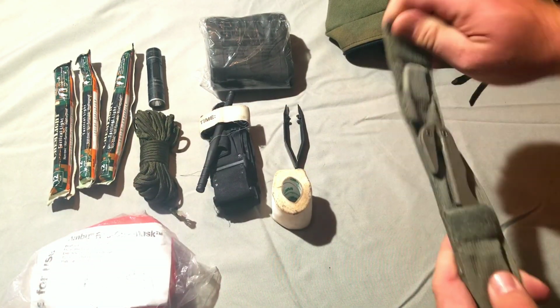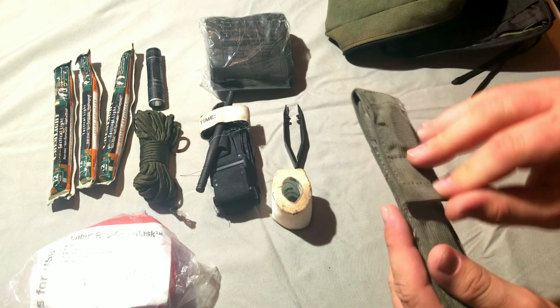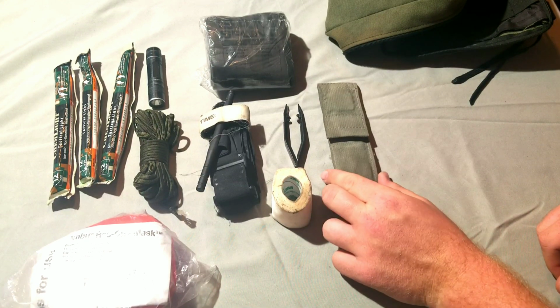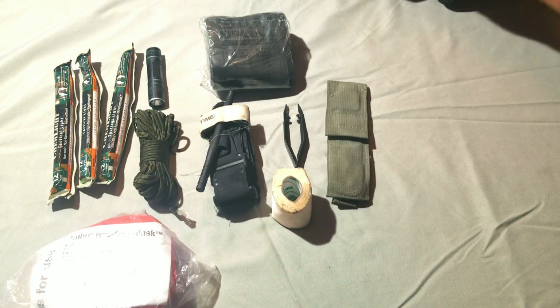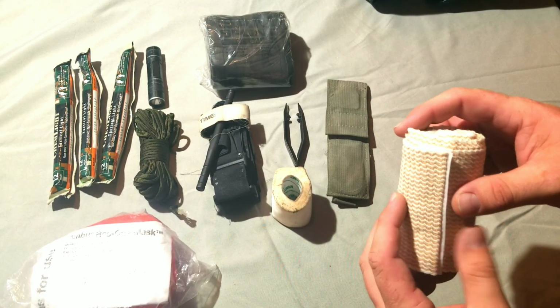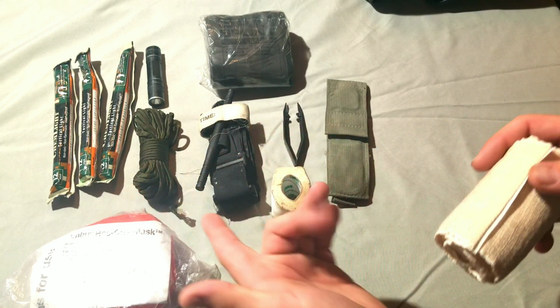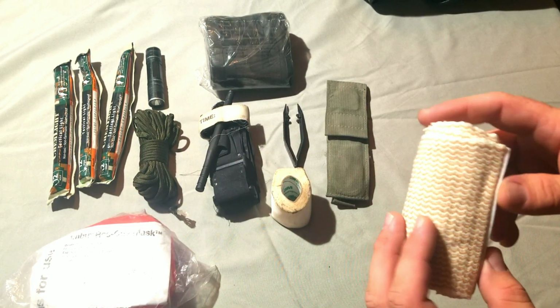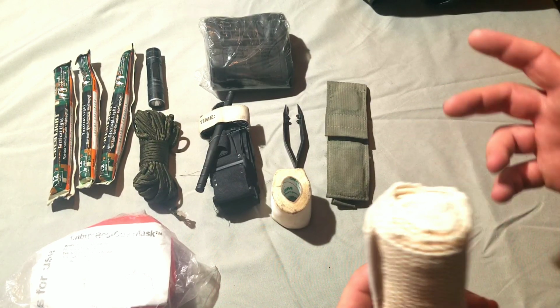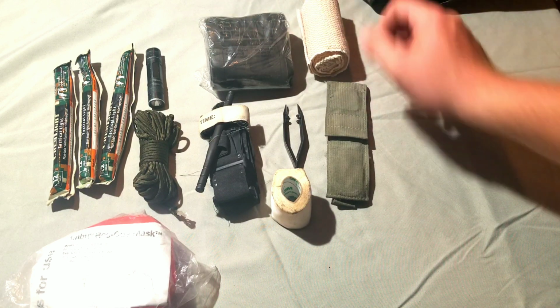You have a seatbelt cutter. Really good to have, especially if someone's trapped in a vehicle or something like that. You roll up on an accident. An ace bandage. Another really good thing to always have. It's very multi-use. It can be used as a tourniquet along with a 550 cord, but you gotta be careful because it's really thin. So something like this could be used as a tourniquet, you know, wrap a sprain, bandages, however you need to use it. Once again, a lot of stuff has multi-use whenever it comes to using it.